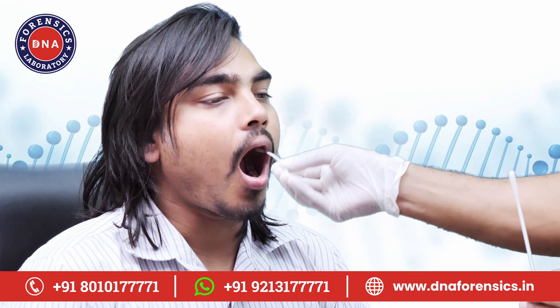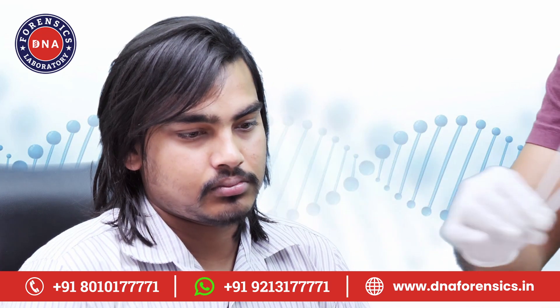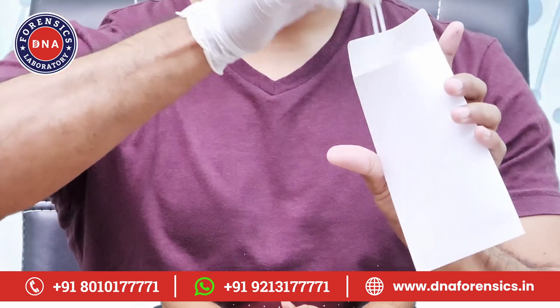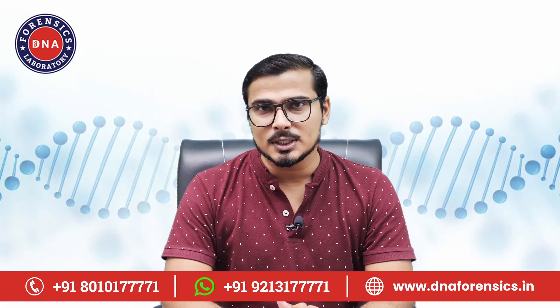After using both the swabs, let them air dry for about 10 minutes by holding and moving them. Now place both swabs of the tested person in their assigned envelope. Always put the ends of the swabs inward when placing them in the envelope.